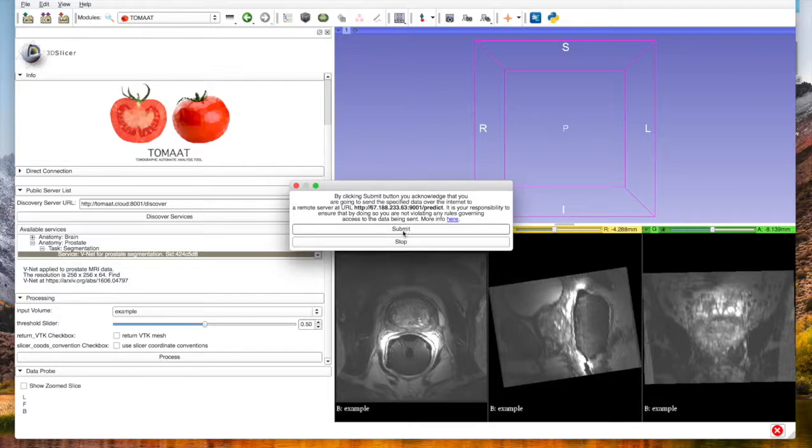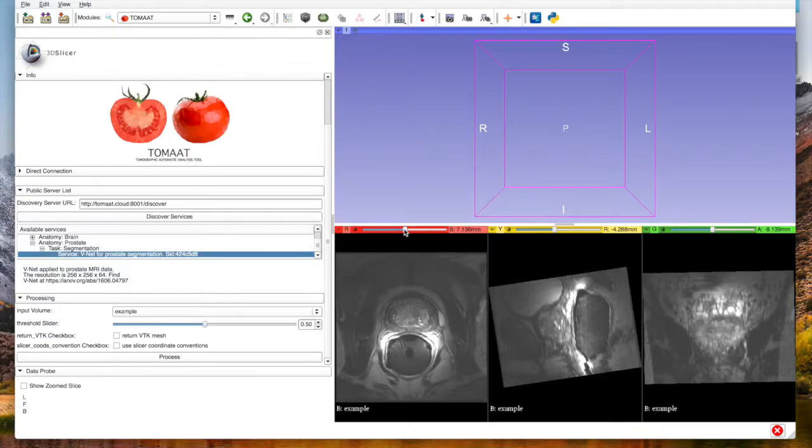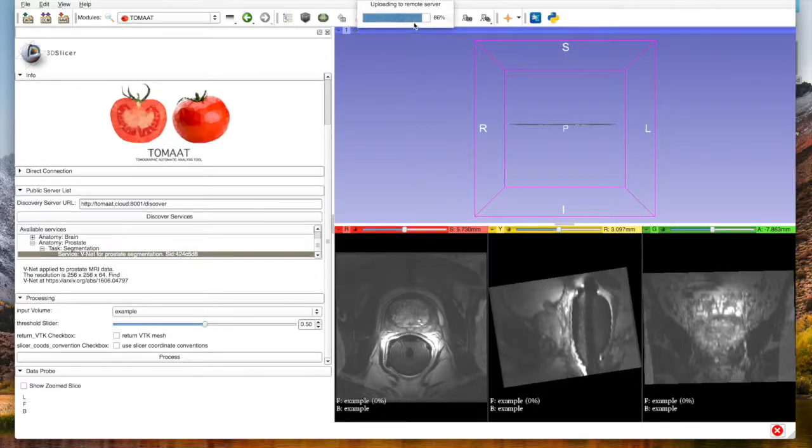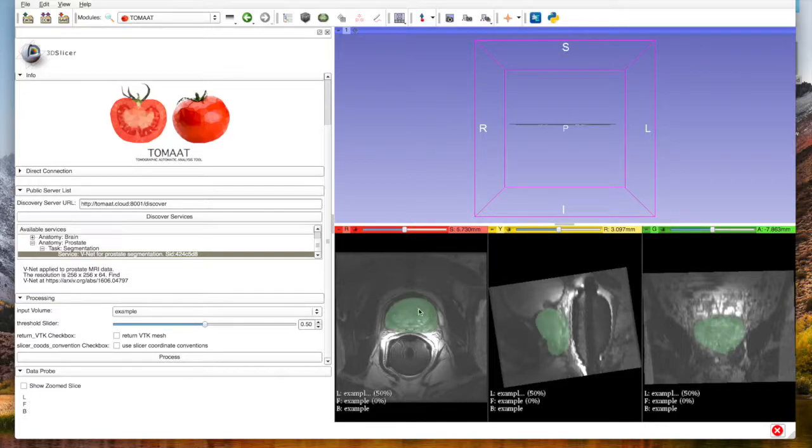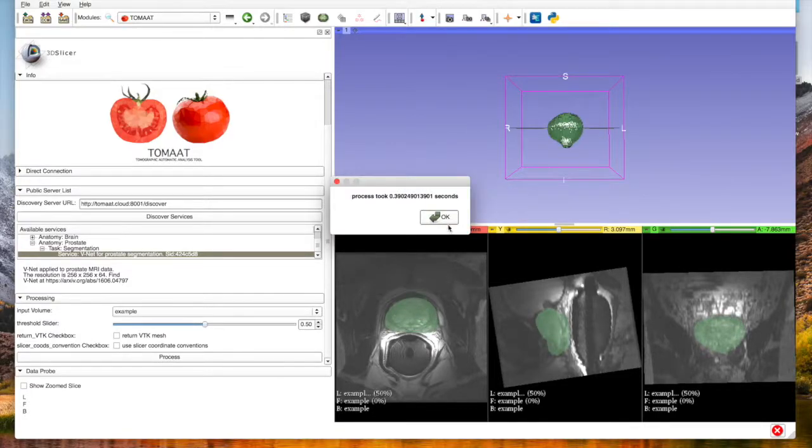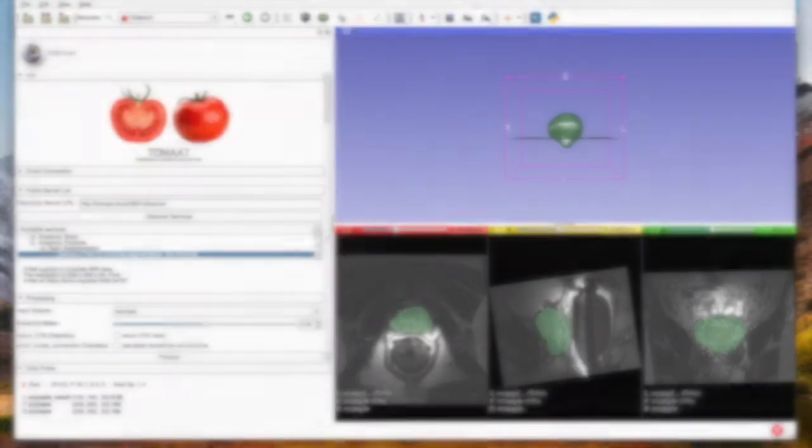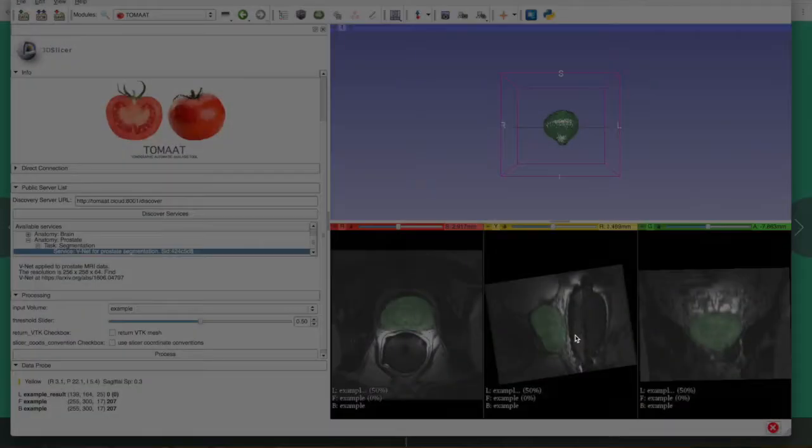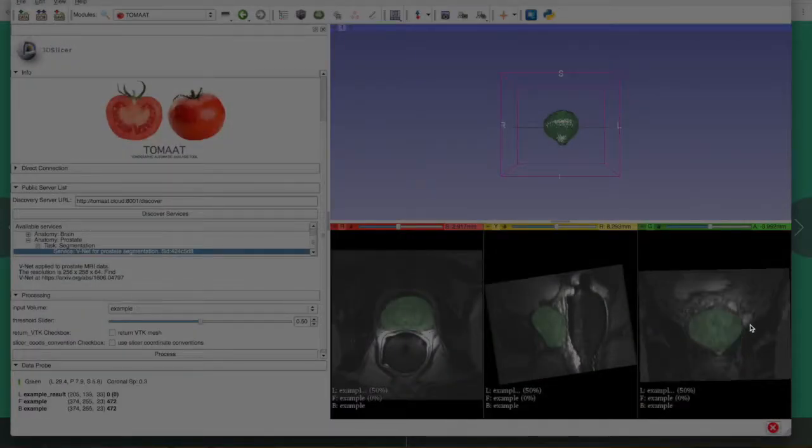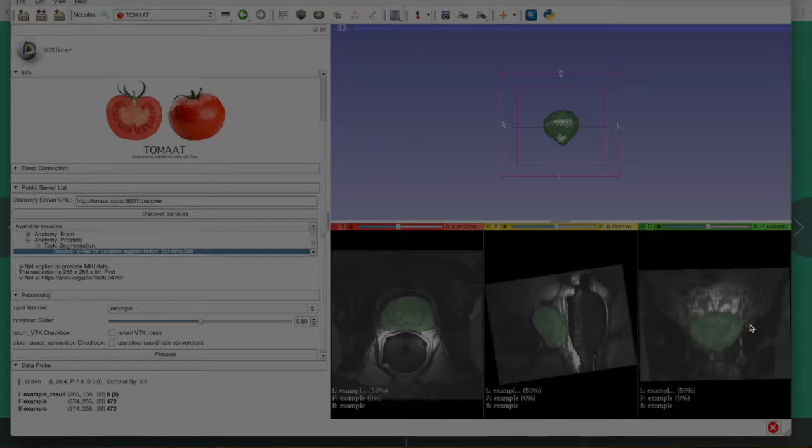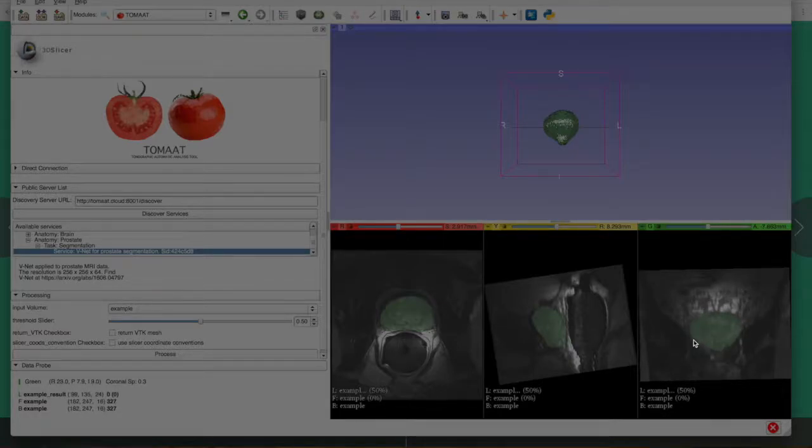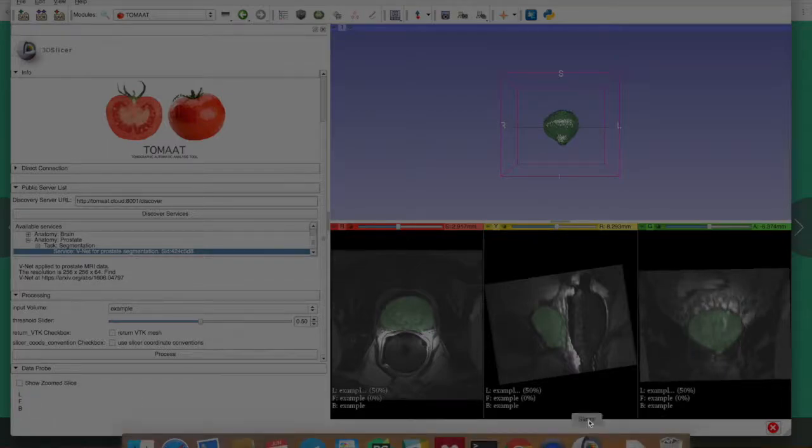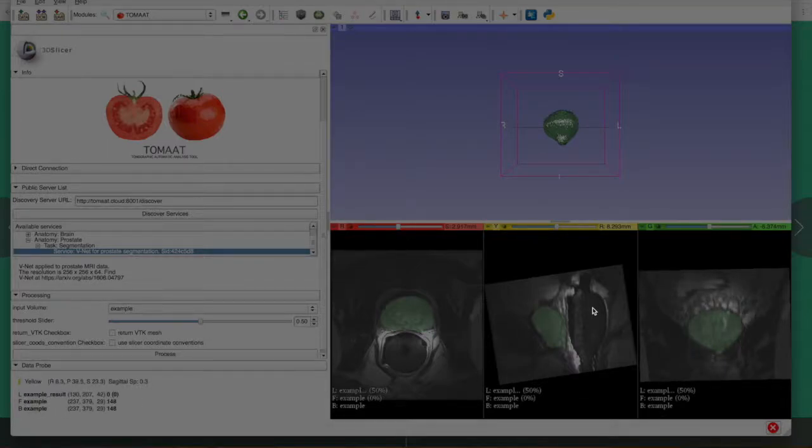All of this has been done through deep learning running remotely on a GPU without the need of having any particular hardware on this client, and in a very seamless manner. Thank you.